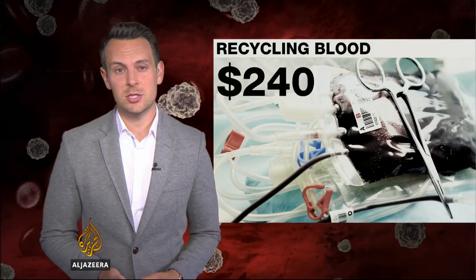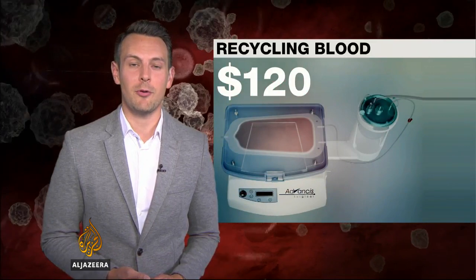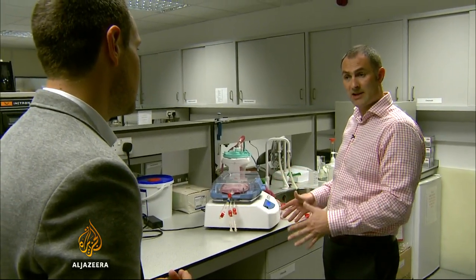A unit of blood costs $240, but parts for this machine are half that price — $120 — and they can even be manufactured on a 3D printer. The actual device itself has a very small footprint, so you can move it to the location that's required, and it is very cost effective compared to current methods.